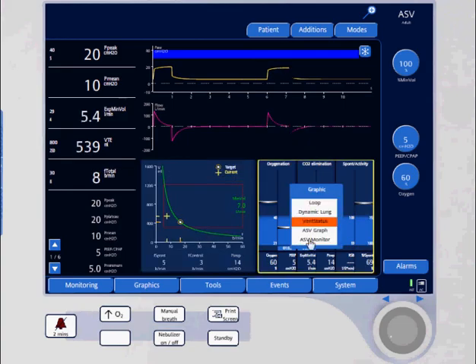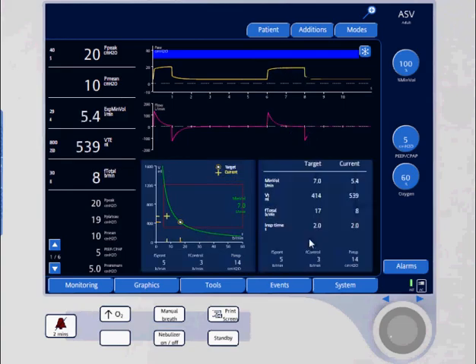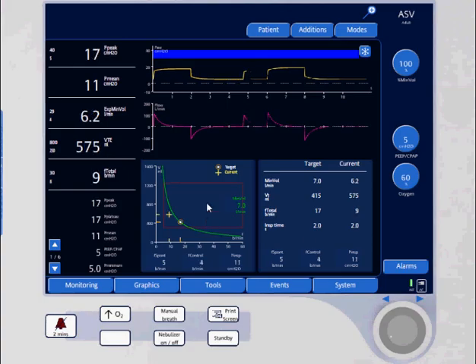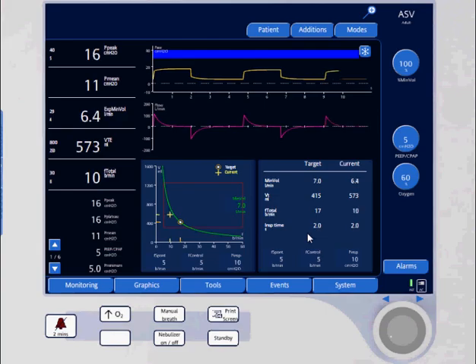The graph shows what the machine is targeting - the least work of breathing pattern - what the patient's currently doing versus what the ventilator is trying to target at this time.